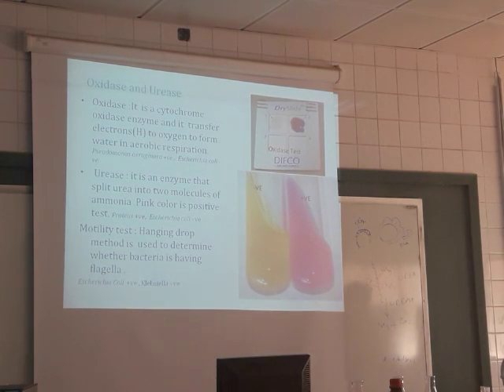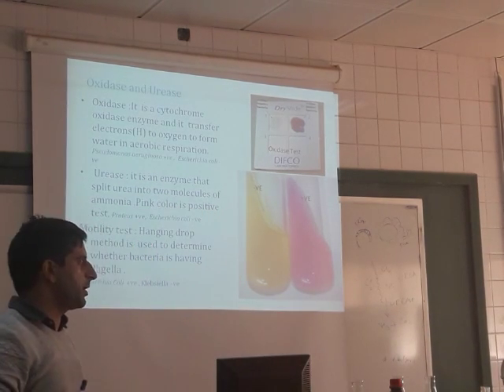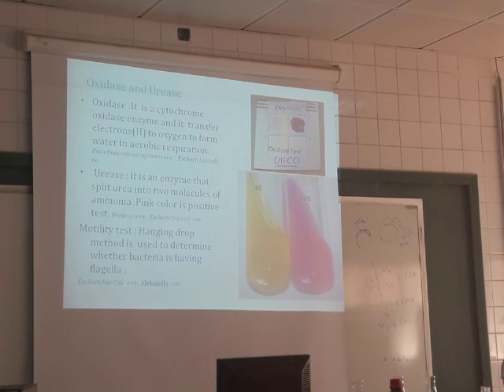So what is the principle of this urease test? The enzyme splits the urea molecule into ammonia. Pink color is a positive test. Because we have one more lab, I think that day I will tell you about the stomach infection, Helicobacter pylori, and how it survives inside the acid content because of this enzyme.